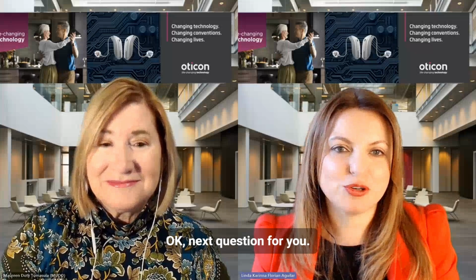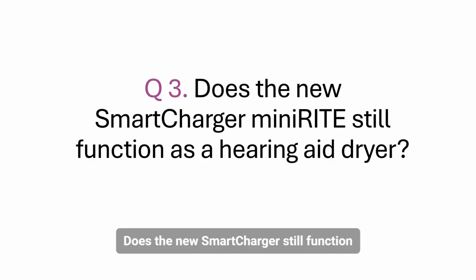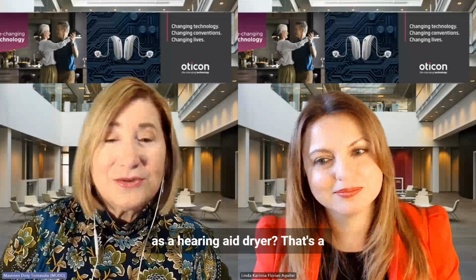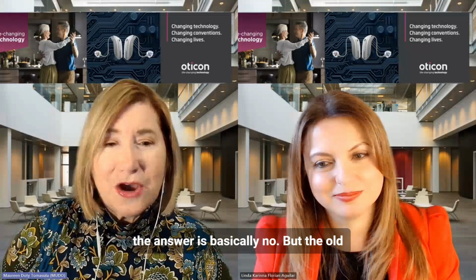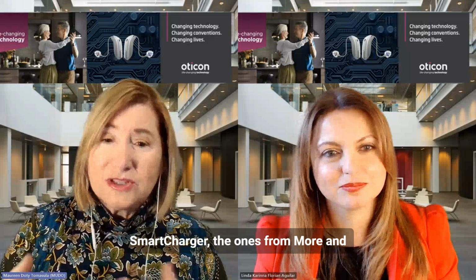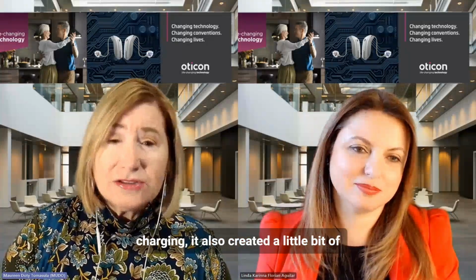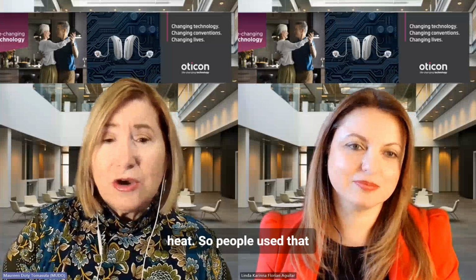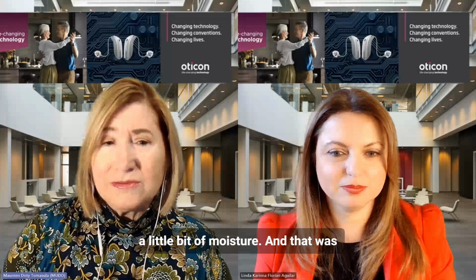Okay, next question for you. Does the new smart charger still function as a hearing aid dryer? That's a really good question. And the answer is basically no. But the old smart charger, the ones from More and Real, because it used inductive charging, it also created a little bit of heat. So people used that to help dry the hearing aid and take out a little bit of moisture.